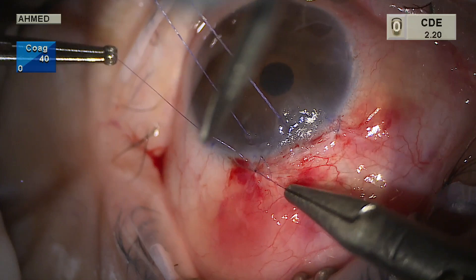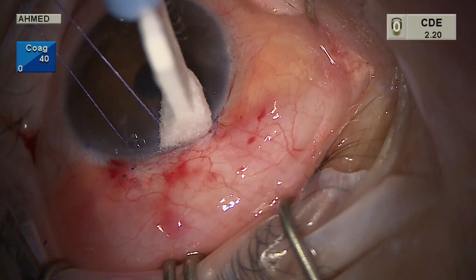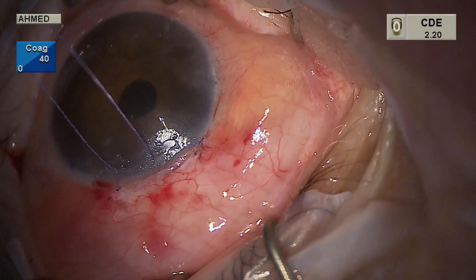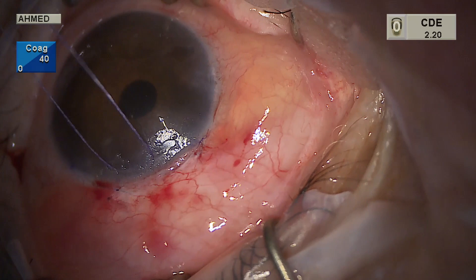Sometimes a horizontal mattress suture is also used at the limbus, but in this case we have a nice tight closure. BSS is injected, elevating a nice diffuse bleb with no leakage at the limbus. This surgical technique was performed by a fellow under supervision, and we see a nice bleb forming with a deep anterior chamber and good pressurization of the anterior segment.